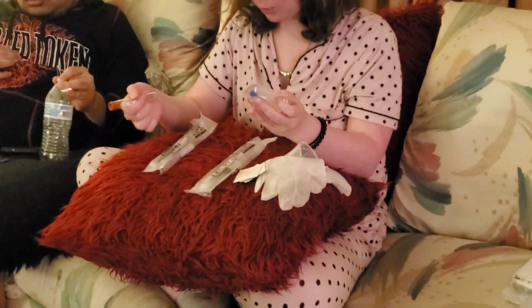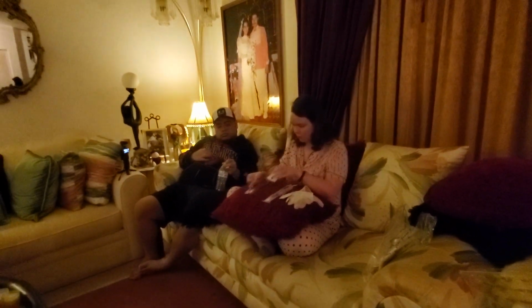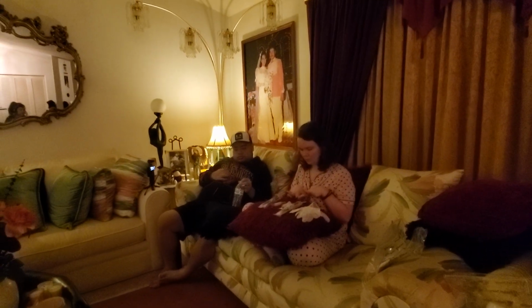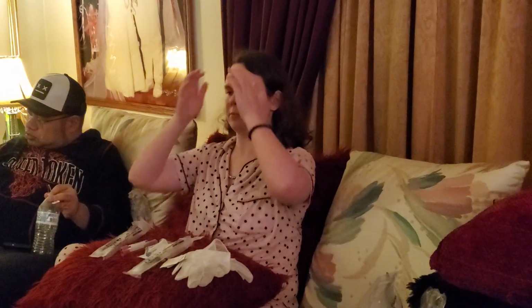Where did the second tube go? It just disappeared. Okay, I found it. It was under the flush syringe. Magic. Okay. Now I'm ready to go. Yeah, there's not really anything else I need other than to just gather my supplies.